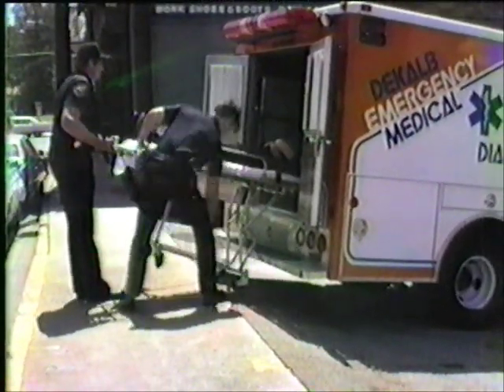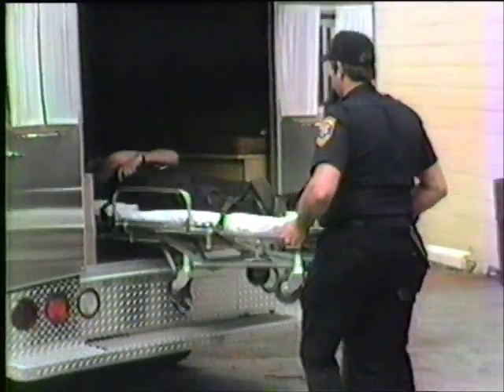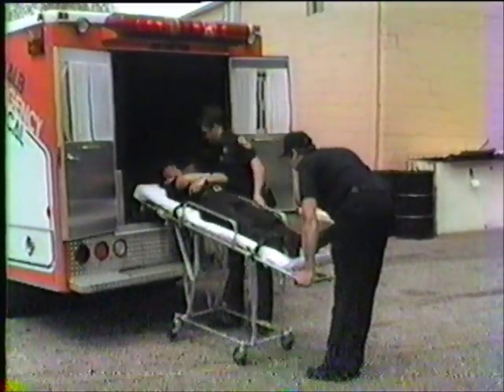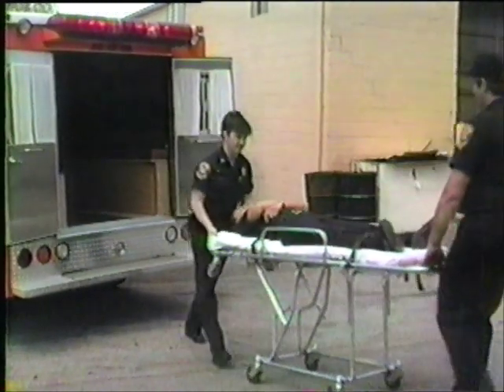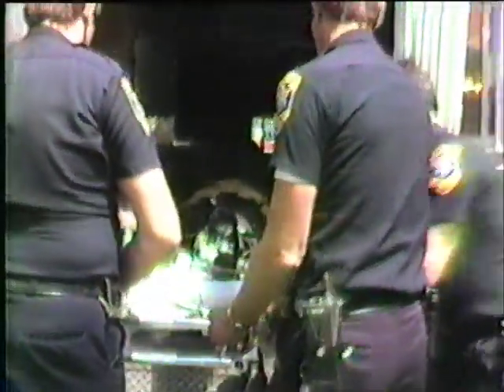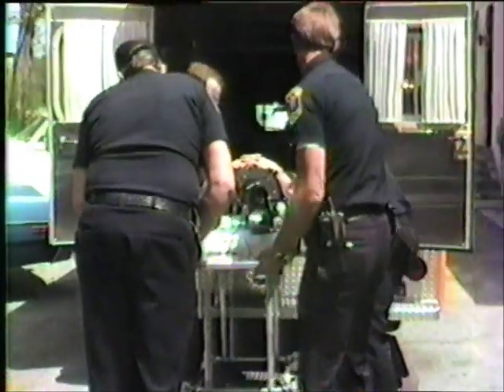Special care should be given when moving the patient into or out of the ambulance on uneven terrain surfaces. If possible, utilize additional trained personnel to safely operate the stretcher. Additional help may also be needed when medical equipment has been applied to the patient, which could obstruct the release handle and the paramedic at the stretcher foot.